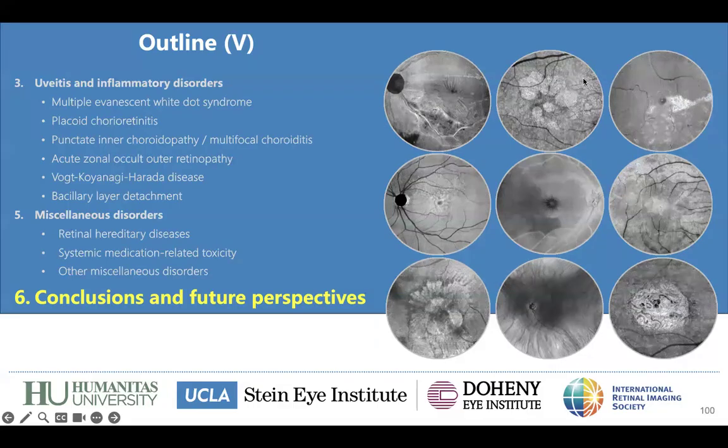Thanks so much, Ricardo. Yes, this is a very important point. I think this is an alternative way to look at en face OCT images, and their applications are very important in this field as well. You were mentioning also the possibility to use heat maps, and I think this is very useful, not only as I showed you, for example, in the context of pachychoroid disease, where we can correlate the thickness map of the choroid with hyperpermeability, but also in the context of AMD, where we can use these heat maps to detect the drusen volume, which is a very important biomarker of progression from intermediate to late AMD.